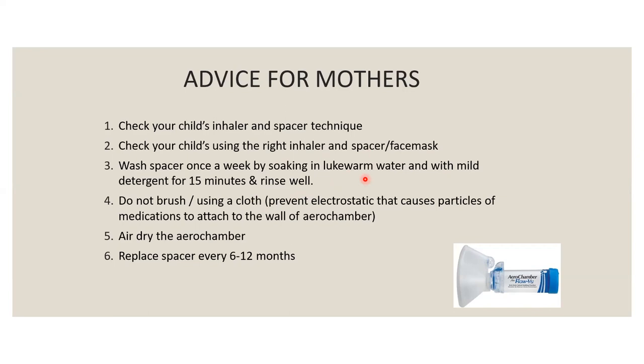The mother should wash the spacer once a week by soaking it in lukewarm water with mild detergent for 15 minutes and rinse well. Do not brush the spacer or use a cloth to wipe it, to prevent electrostatic charge that will cause the particles of the medication to attach to the wall of the aerochamber, which will reduce the delivery of the medication to the lung. The mother should air dry the aerochamber and replace the spacer every 6 to 12 months.